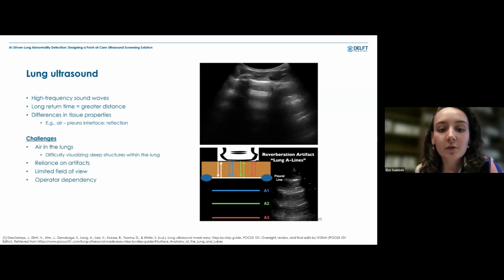Thank you. And this is an actual ultrasound image. You again see the ribs causing a large rib shadow. There are 2 ribs in this image, and then a pleural line in between the 2 ribs, and A lines, those horizontal lines below the pleural line.